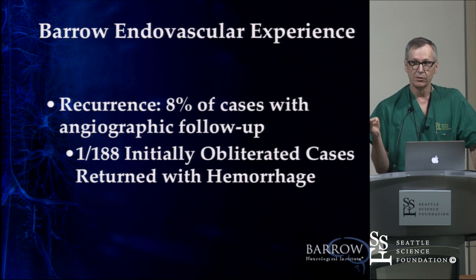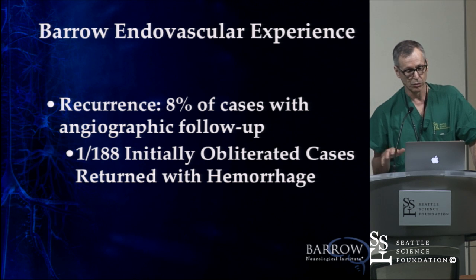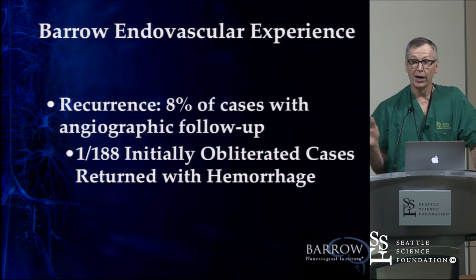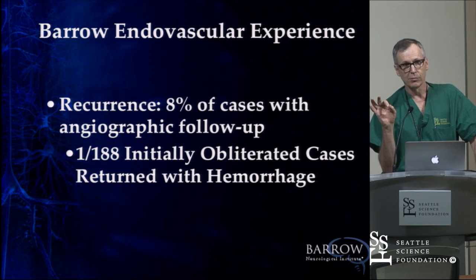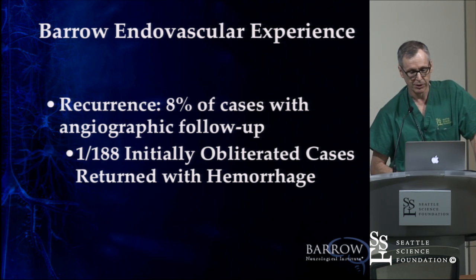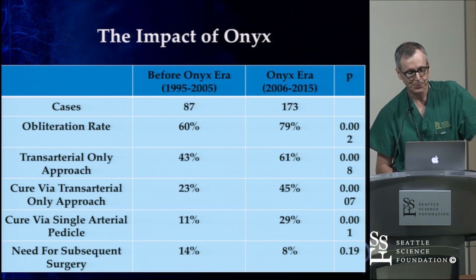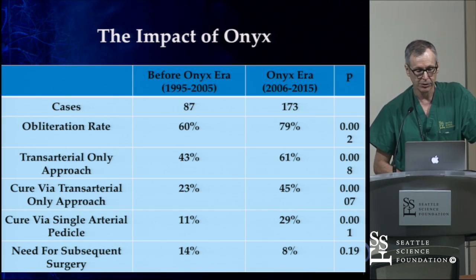And by that time, you'll see really nice regression of all the enlarged arterial feeders that were there. That will all regress to normal, and it becomes very clear as to whether or not they're cured. So I think Brad is counting some of those patients that we brought back for follow-up, and counting some of those as recurrences, because if you get them to that 3-month or later period and you've seen regression of the feeding arteries and you're not seeing any fistulas, I have no recollection of any cases recurring after you've got that delayed confirmatory angiogram. So that's really the point that I evaluate them at, certainly not the initial time of treatment. You can be reasonably confident, but I just don't trust these fistulas to say they're cured at the initial time of treatment.